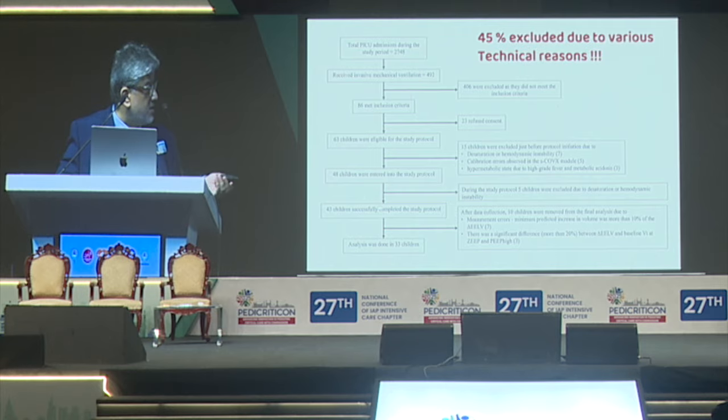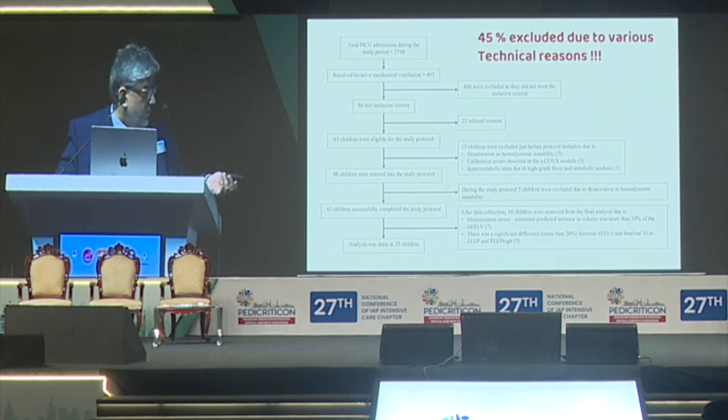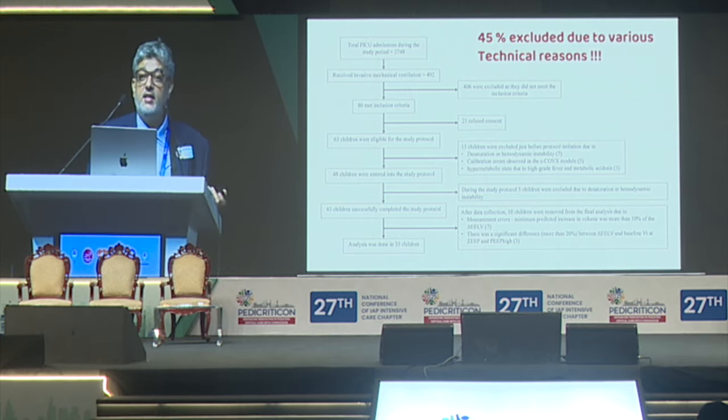And we can see here 63 children were eligible for the study, and we performed this PEEP-step maneuver. We measured the end expiratory lung volume using the nitrogen multiple breath wash-in wash-out technique at 0 PEEP and at high PEEP. But we can see here, interestingly, that only 33 patients were finally enrolled in the study because so many children had to be removed from the study because of various technical reasons. Because it is not easy to perform a nitrogen wash-in wash-out technique and measure an FRC at 0 PEEP and then perform a PEEP-step maneuver.